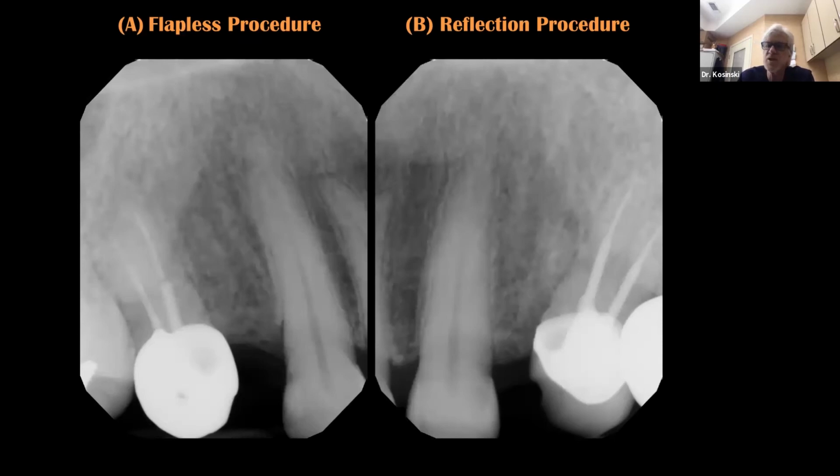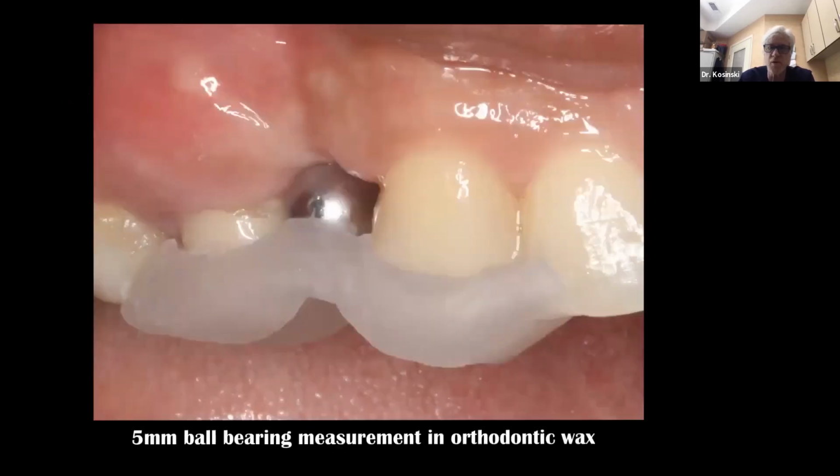What about mesial distal width? Well, your x-ray on the left side looks like we may have adequate room for a tooth. On the right side, maybe not so much. But again, a lot of this has to do with the angulation of the radiograph that we're taking. So this is our preliminary determination of whether or not the patient is even a candidate. Obviously, we're also looking at the health of the patient. We're looking at their past dental history in determining what's correct.